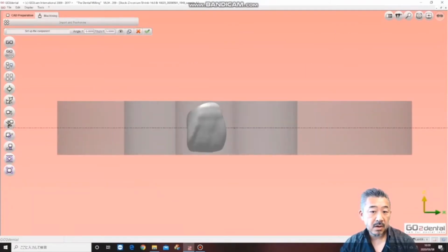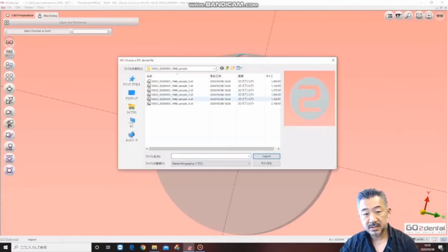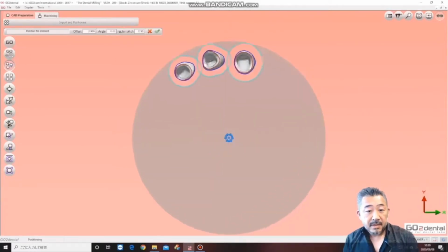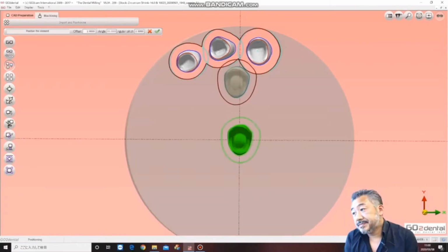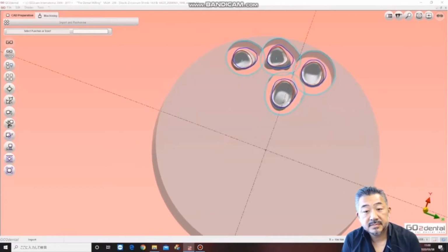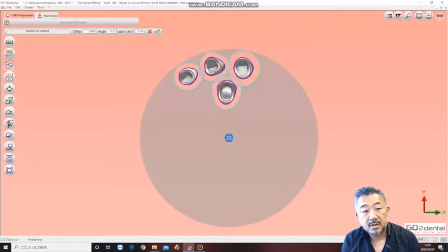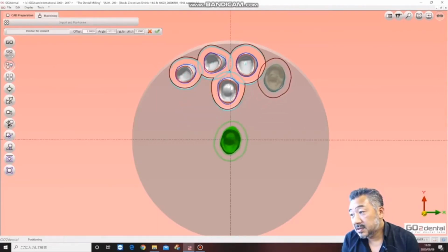The offsets can overlap to minimize wasting milling. It also saves zirconia discs, right? After placing the front teeth, let's place the molars. See? So you should find the best place.